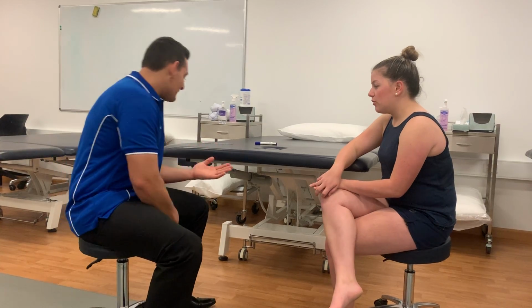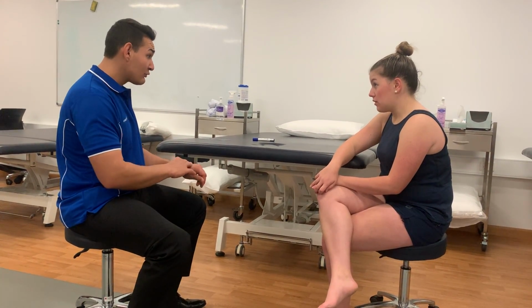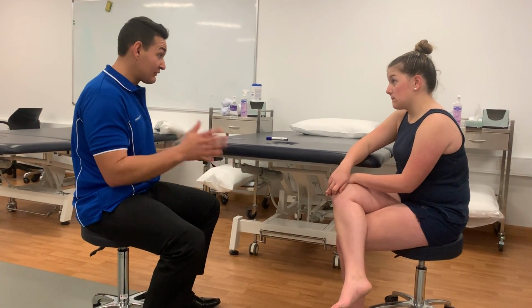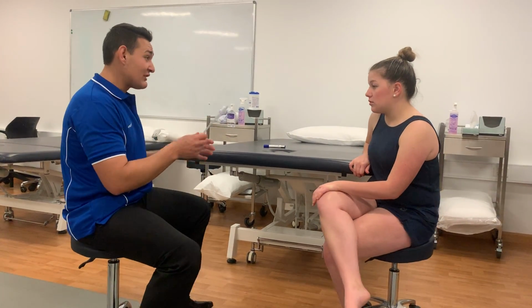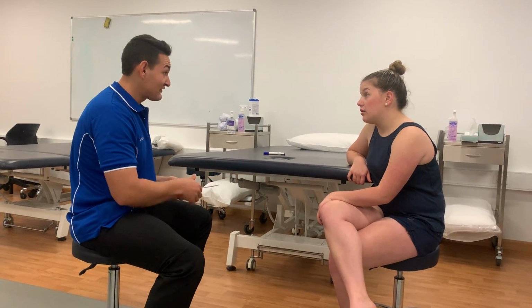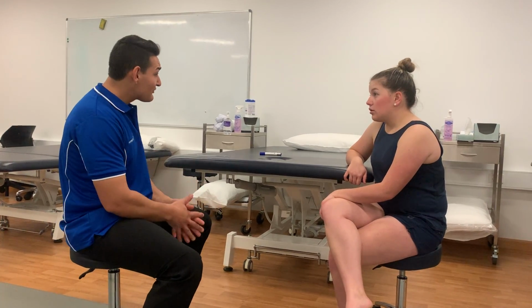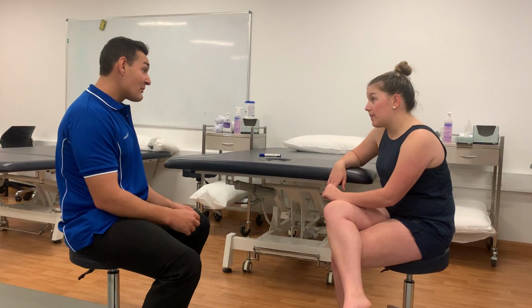Thank you. Okay, and also Simone, we're going to do your left hand side first, your left wrist, because that will give us a comparative value to show the difference between the right and left side. We'll be using this fancy tool called a goniometer. It's just a fancy way of measuring, and it'll show us the angles of your wrist. Do you have any other questions today, Simone? No, I don't think so. Okay, and you've understood everything I've said? Okay, do I have your consent?